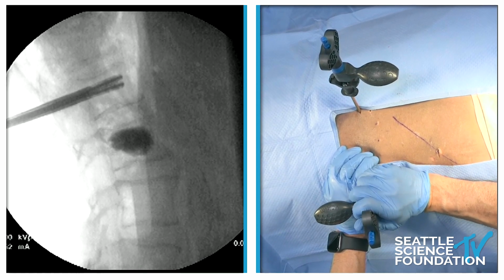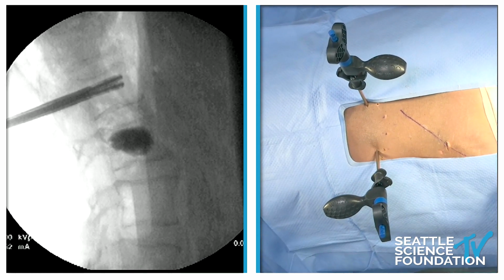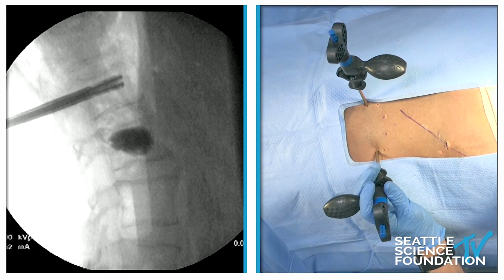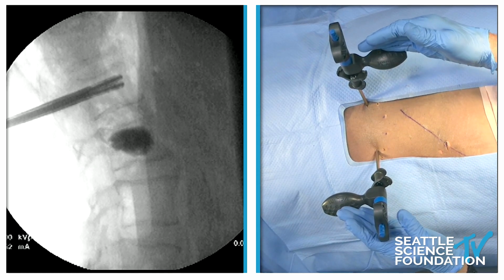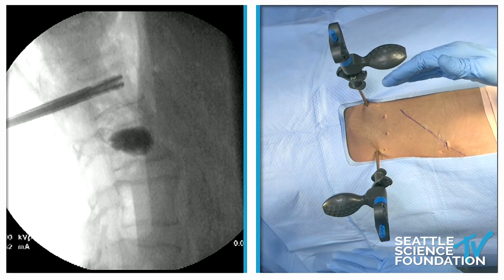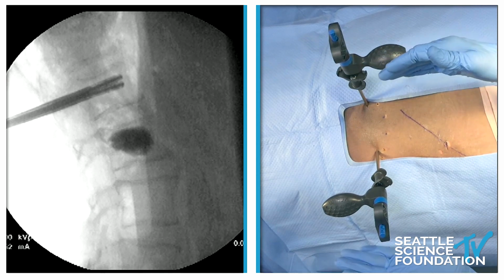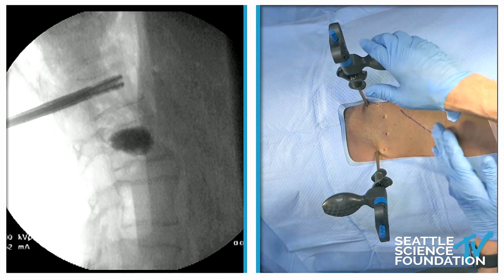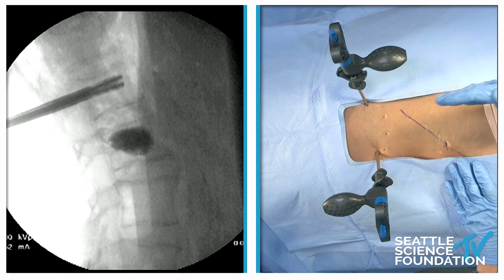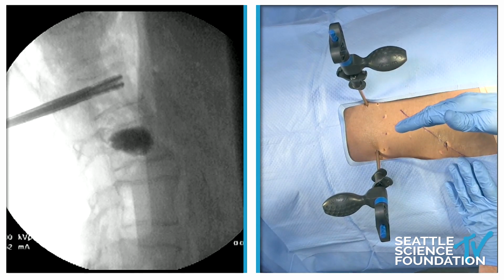And so they're right, almost overlapping each other, which is okay. We want to get the maximum amount of lifting force. And whether the handle is up or down, it doesn't matter. It deploys the similar distance, superior and inferior, up or down. And so we're going to deploy like this and like this, as long as this is deploying perpendicular to the end plate, pressing up against it.